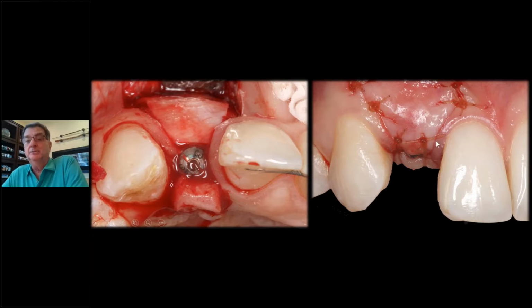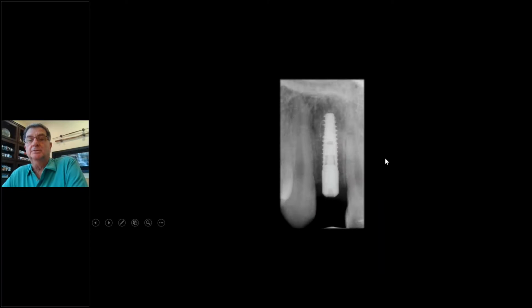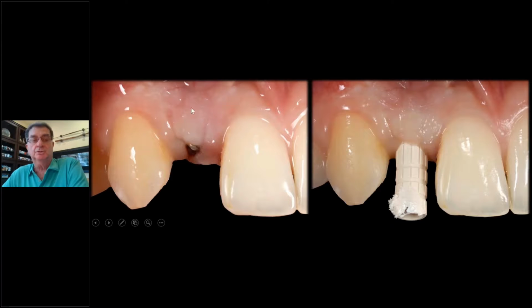And now I leave the papilla intact. Nothing's going to happen to it because I haven't done anything to it. We replace the bonded bridge, retack it. There's the implant placement, nice and clean. And here you see, now you do see the groove here, see? Initially, you're going to see that, but it tends to blend in. If it doesn't blend in enough, like here, it's almost gone already. And here, it's still a little bit of a groove, but it's a groove.